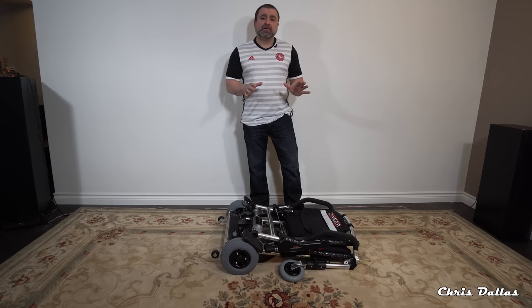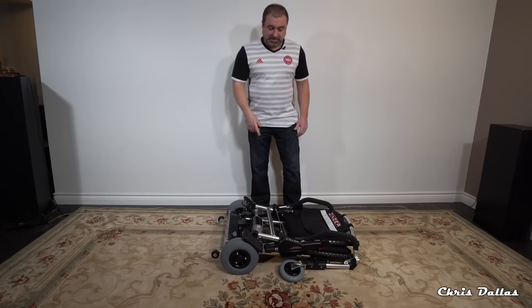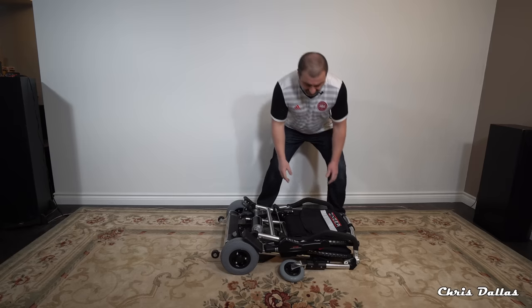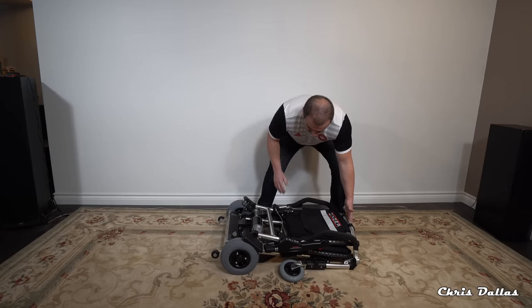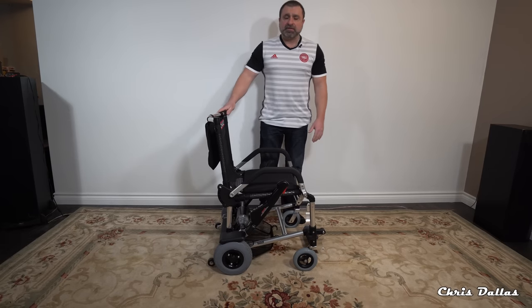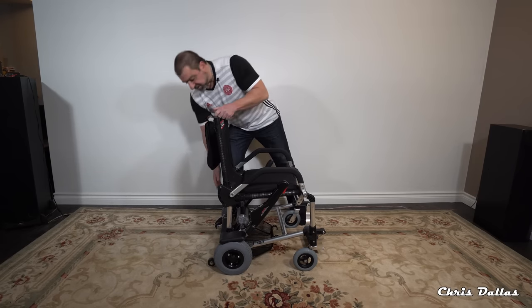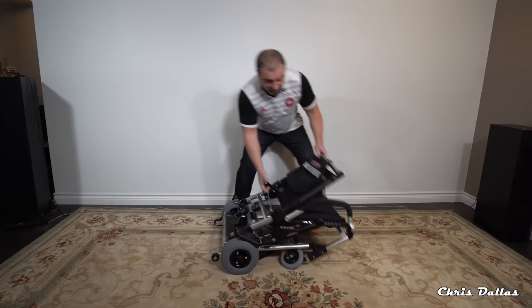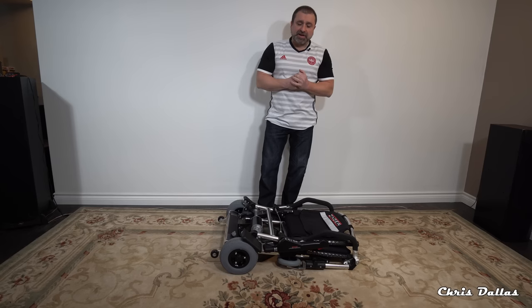I'm going to demonstrate the unfolding and folding right now. There's a latch over here that you need to pull — this latch here — and you hold it by the handle. Pull the latch and the chair is ready to go. That's it really. You want to fold it? Same thing. Pull the latch. Done. In one second you can fold and unfold this chair. The chair is phenomenal.